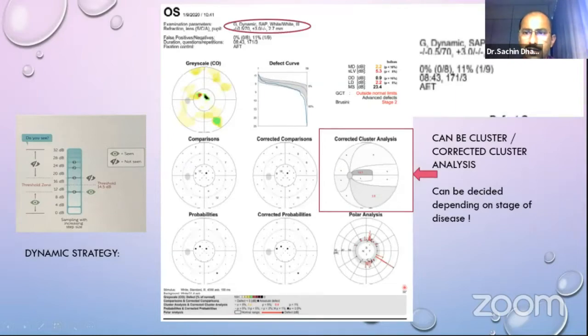And here you get all the dimensions like the pupillary diameter, the false positive, false negatives, testing time, and the type of fixation monitoring that is used. So all the information that is there, what you see in the Humphrey above is given here, in similar fashion, including the pupillary diameter, and the only additional thing is the automated eye tracking, which is slightly different.